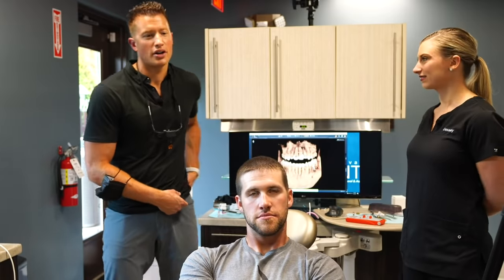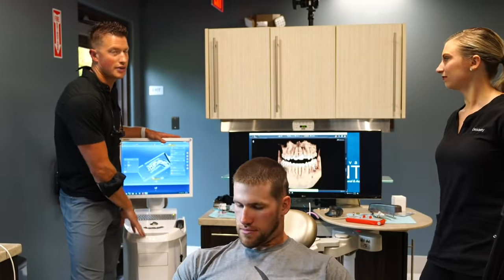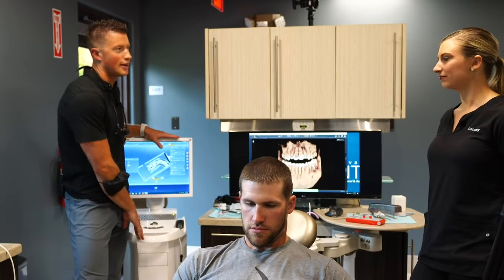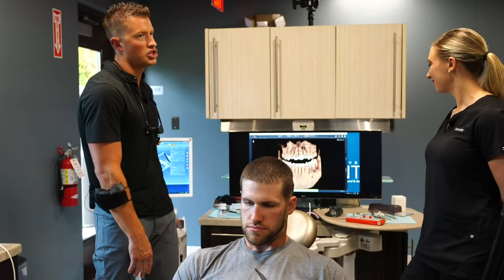So if an office does CEREC crowns, does that mean they can do 3D X-rays? Good question. If an office does CEREC crowns, it does not mean that they can do 3D X-rays. CEREC crowns are a component of this machine right here. This is called an acquisition center, and this machine is designed to image teeth. It does not do the 3D X-ray.